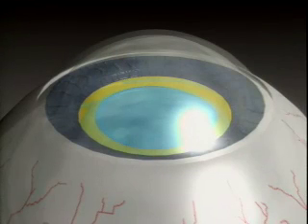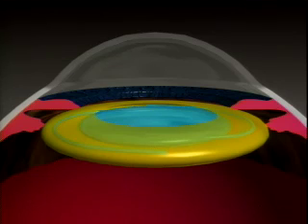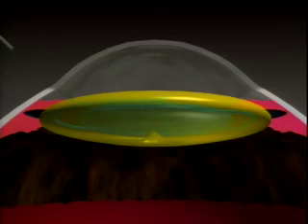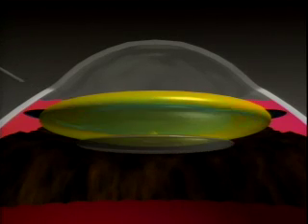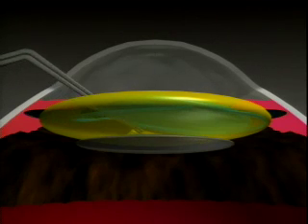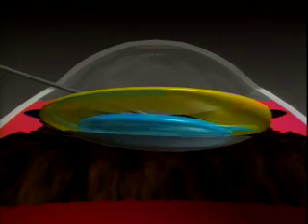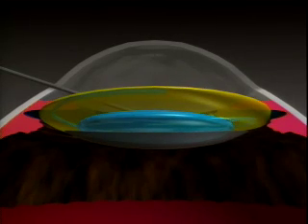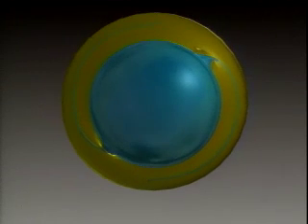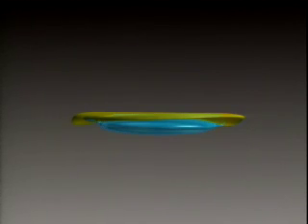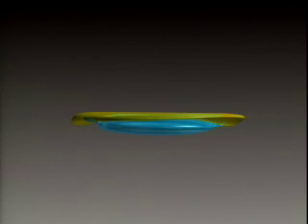Computer animation gives another view of the technique of posterior capsulorhexis with optic capture. It is a technically challenging procedure that should not be performed unless the surgeon is familiar and proficient with capsulorhexis techniques. After the initial puncture, viscoelastic is placed through the small opening to push the vitreous face away from the capsule. With this viscoelastic cushion, the vitreous face is protected as the IOL is nudged through the PCCC. The final result is a stable and central IOL with apposition of the anterior and posterior capsule leaflets anterior to the IOL. Fusion of the leaflets should occur 360 degrees except at the haptic-optic junctions, with the resulting sealing of the bag.